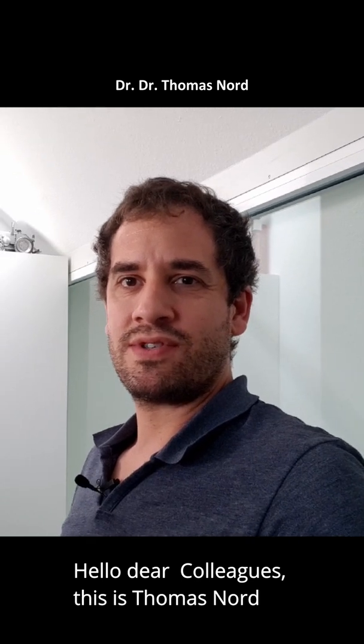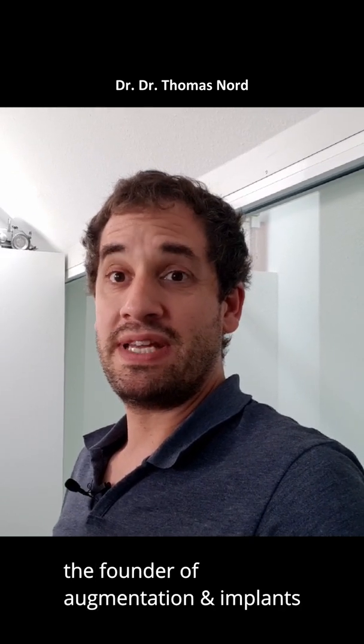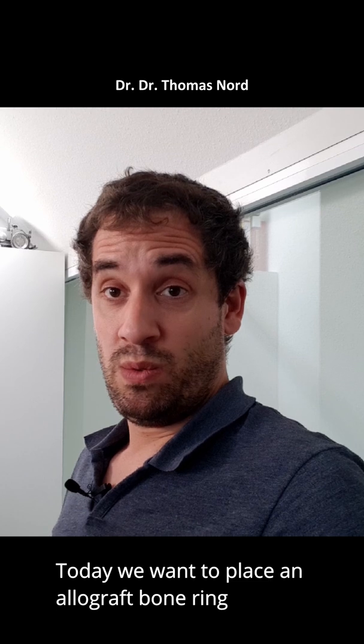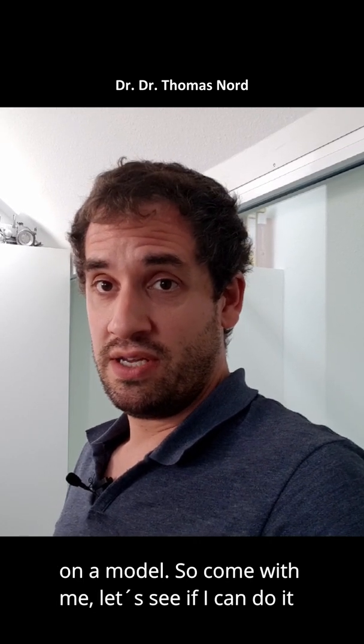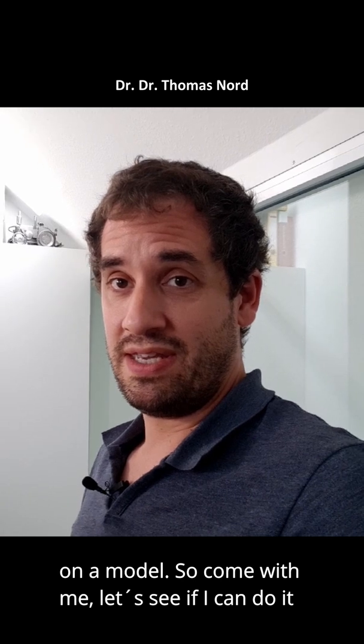Hello dear colleagues, this is Thomas Nord, the founder of Augmentation Implants. Today we want to make a bone ring — an allograft bone ring — on a model. Come with me and let's see if I can do it.